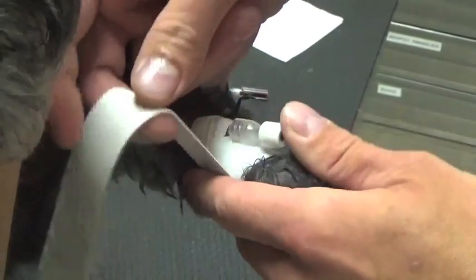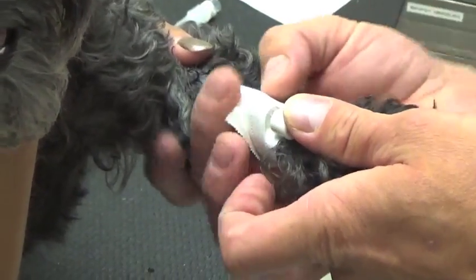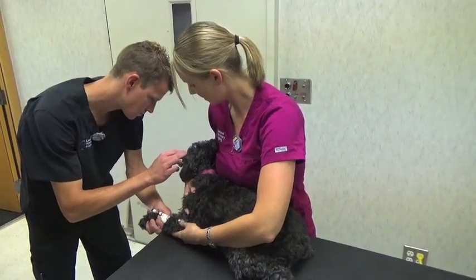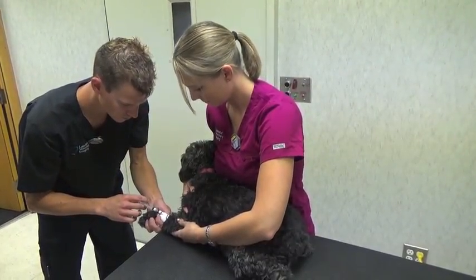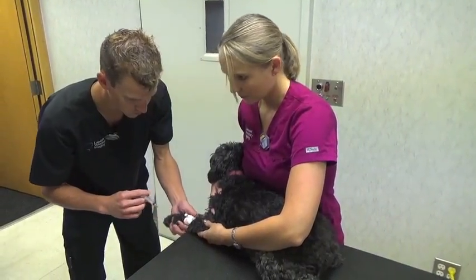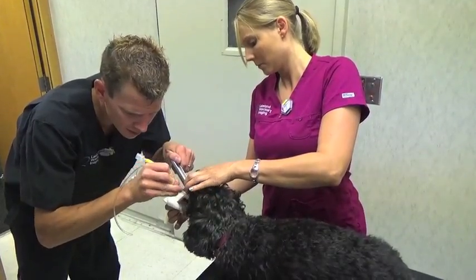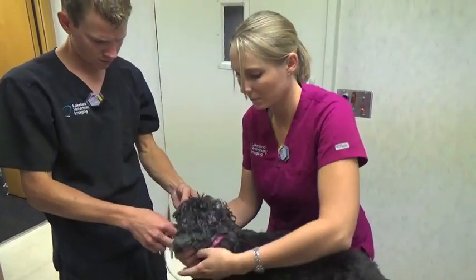Back in the control room, our doctors are once again reviewing the patient medical record to provide a concise history for our consulting radiologists. When the patient and team are ready, anesthesia is induced using an injection and a breathing tube is placed in the trachea.